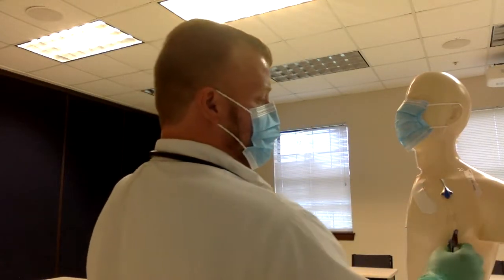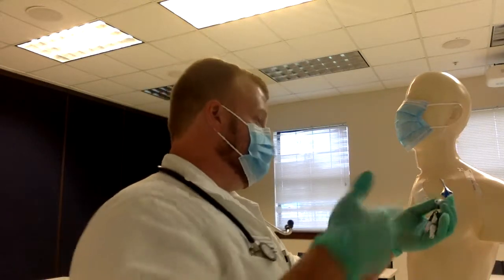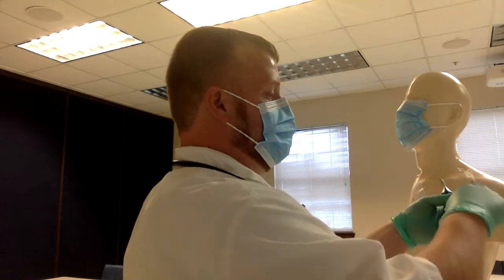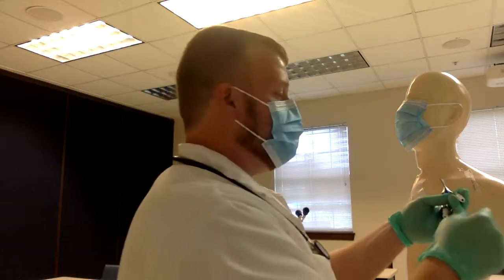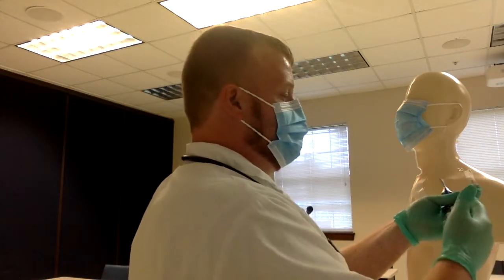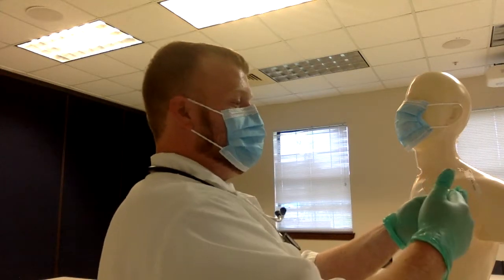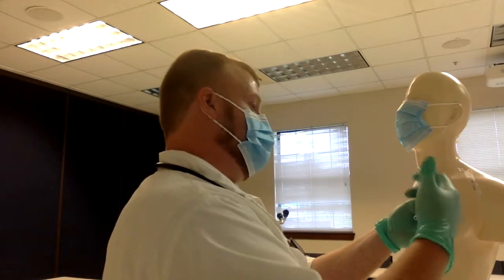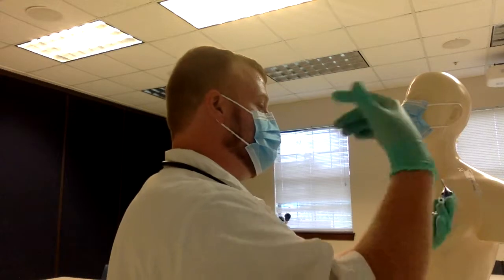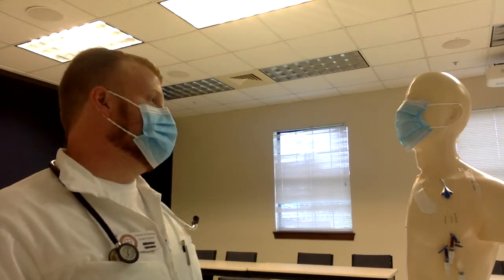For the maintenance of these, it's per facility policy, but you take your flushes. I know at Regency and Forest General it's every shift, so every 12 hours you flush the lines to make sure they're patent, because I'd hate to get in a predicament where you want to push medicine through it and it doesn't work because it's occluded. So for maintenance, we unlock it, obviously, flush the line, and keep up the upkeep on it. Again, that was a pretty quick run through of this.